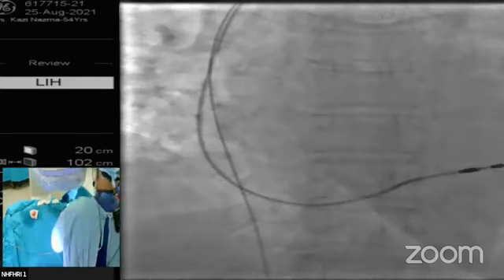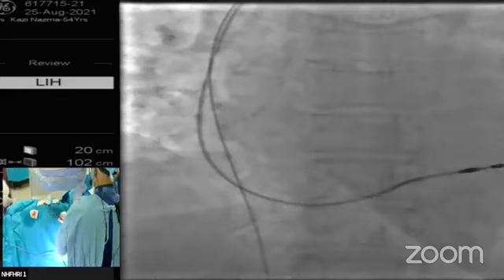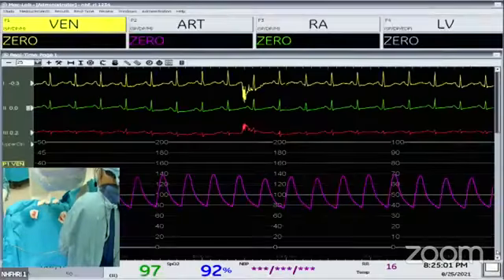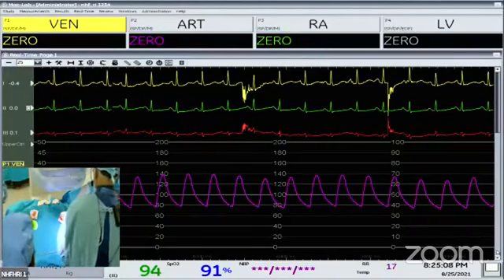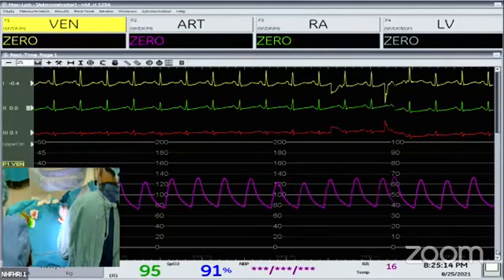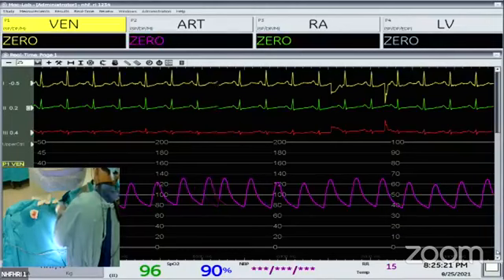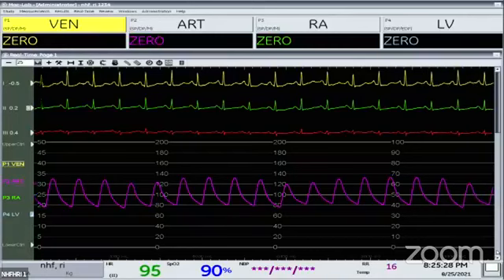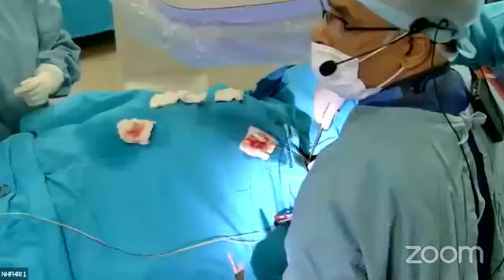Light, please. Right angle, right angle. Okay. Hold the light from this side. What should be the exact level of impedance you are satisfied with? Impedance depends on the lead of different companies. So it is around 500 to 1500, sometimes even 1800 for some companies. So this is a range, not a fixed number. It should not be less than 400 or 300 and should not be more than 1500.